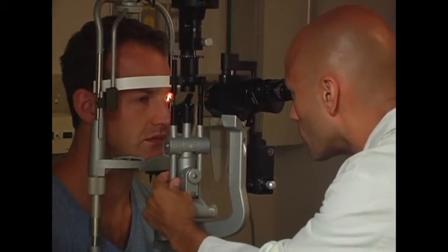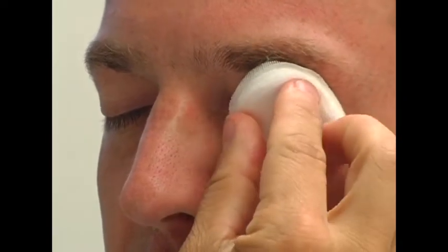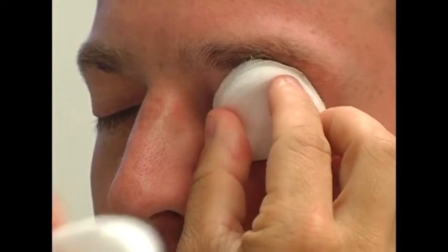Apply antibiotic ointment to the affected eye. Have the patient sit with both eyes closed and tell the patient to keep both closed until the patch is applied and secure. Take 1 cotton oval eye pad, fold it in half, and hold the pad gently but firmly over the closed lid of the eye to be patched.